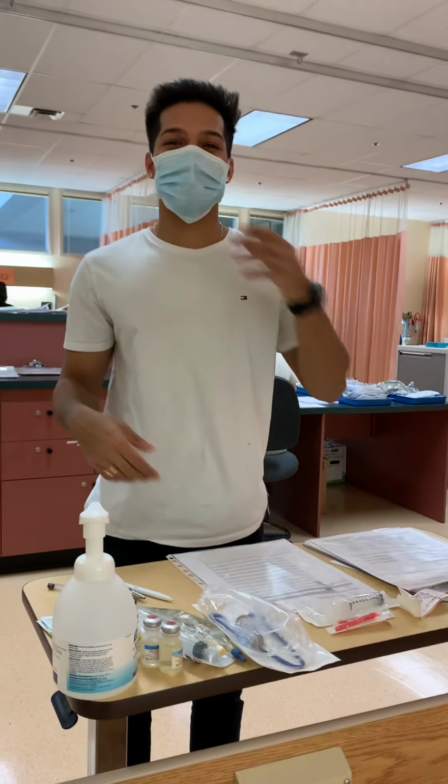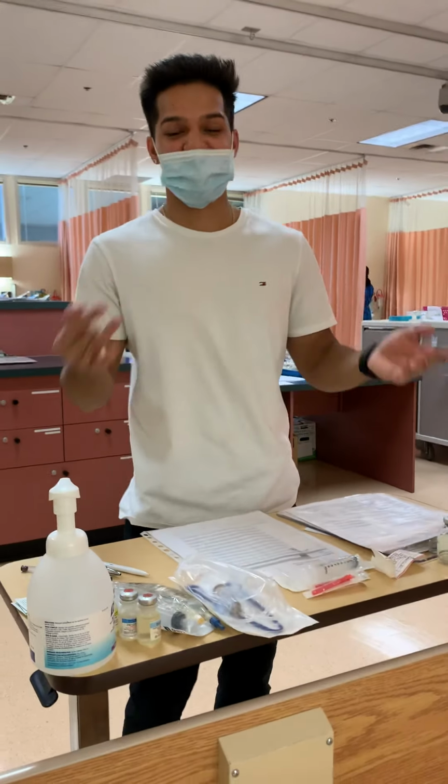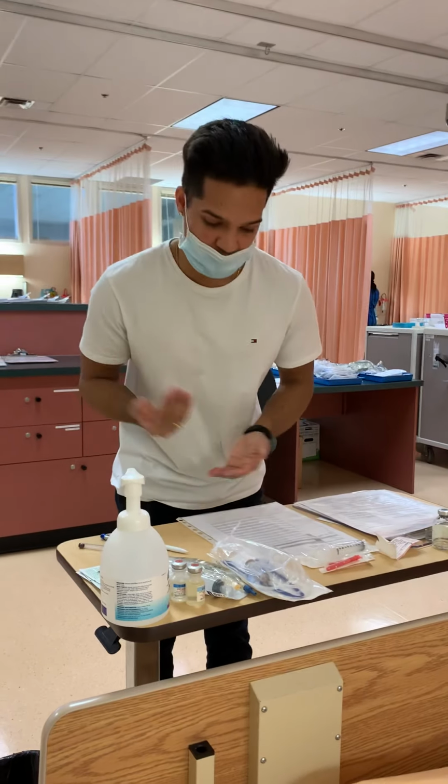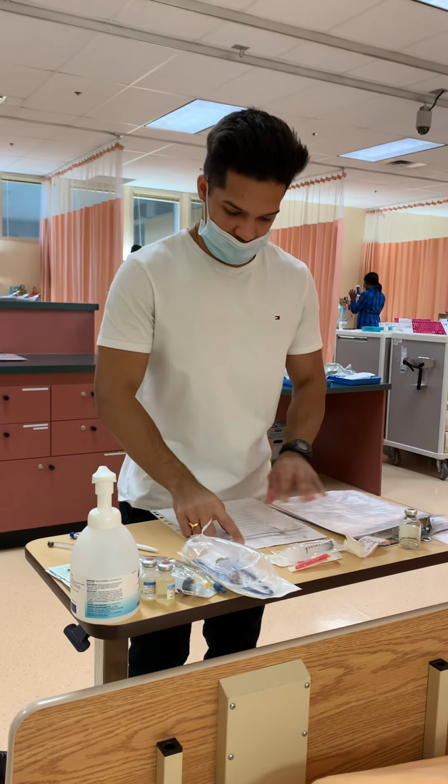Today I'll be demonstrating how to give IV meds via minibag. The first thing I'll be doing is comparing my physician's order to the MAR, but I know my physician's order has already been transcribed onto my MAR correctly. So right now we're just going to be looking at our patient and checking the MAR.